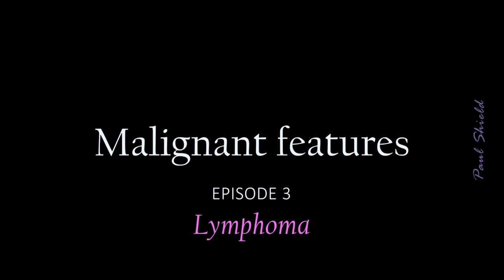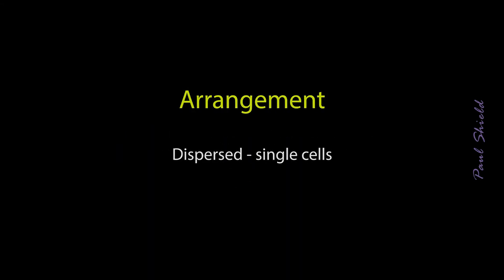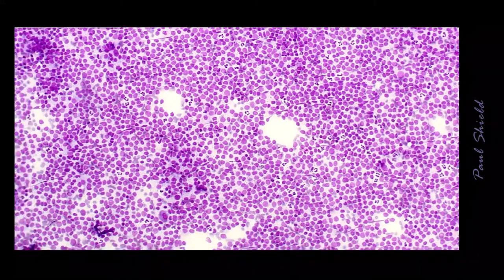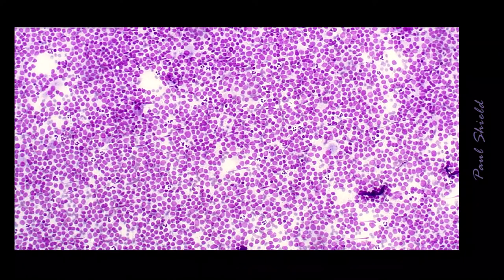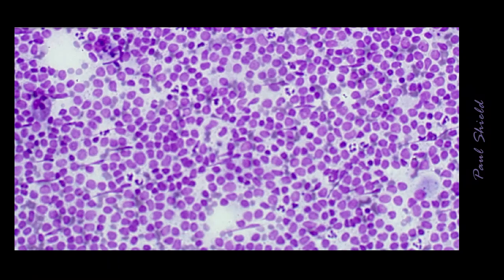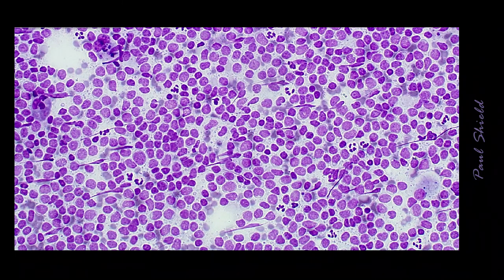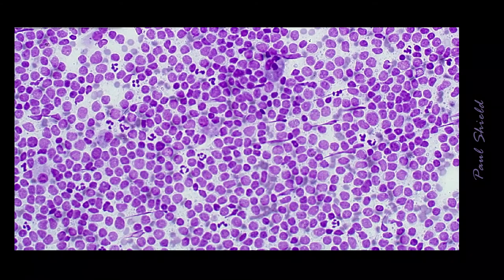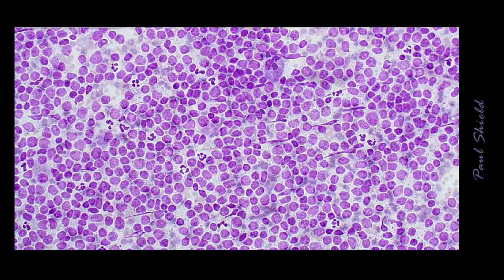Let's look at lymphomas. We'll be looking at a generalised pattern for these in cytology specimens. Characteristically, lymphomas are always arranged in a dispersed pattern with single cells. Here's a typical example. It's almost like a monolayer of cells spread across the slide. None of them are forming really cohesive groups or anything remotely organised. There are some cells that are touching each other, but they're not growing together or forming a community border in the sense of a gland or anything like that.